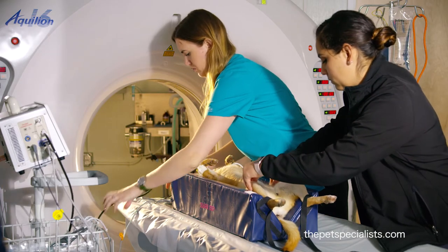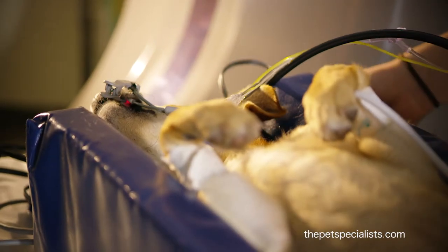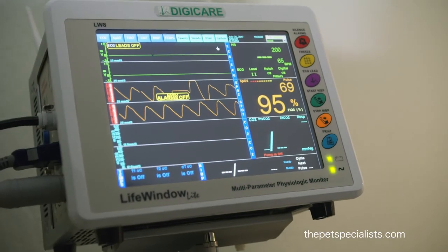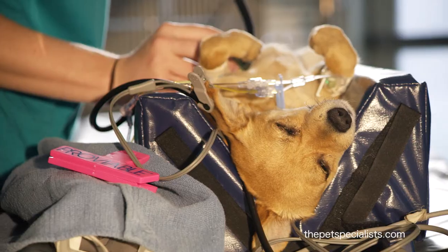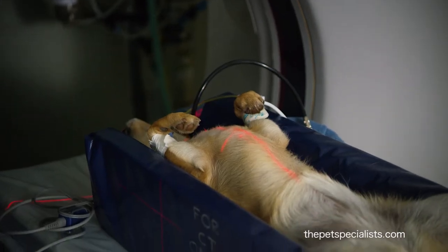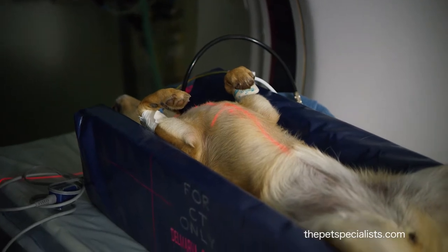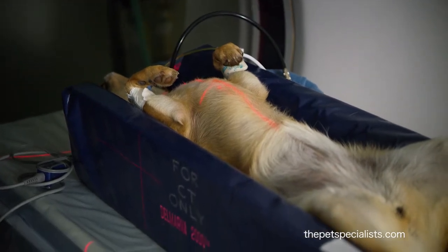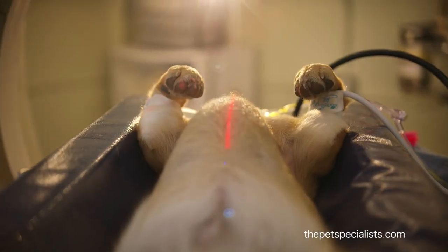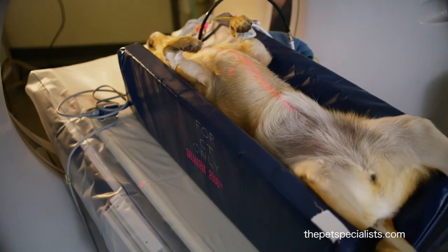We give a little rotation to make sure that the elbows are identical in position when they are imaged, which allows us to compare one elbow to the other, looking for disease on both sides. There's a laser device that is used to mark the exact center of the joint, and then the patient slowly moves through the imaging center as it collects the images.